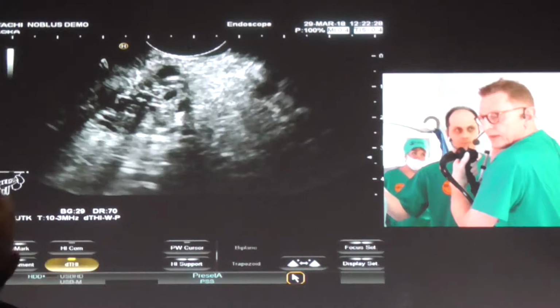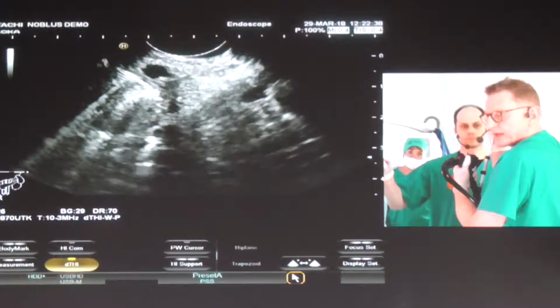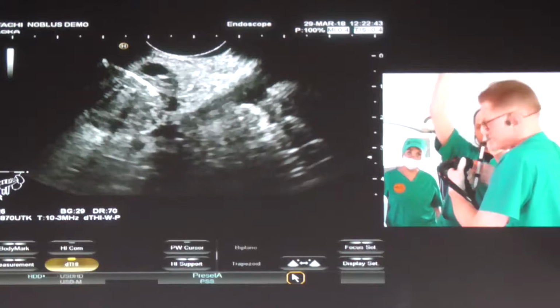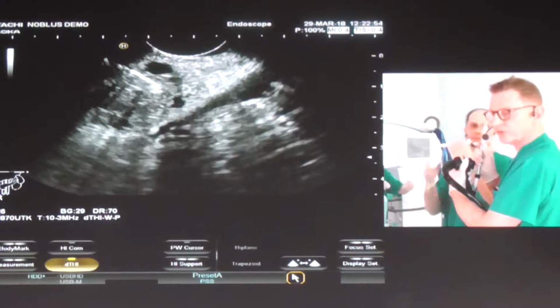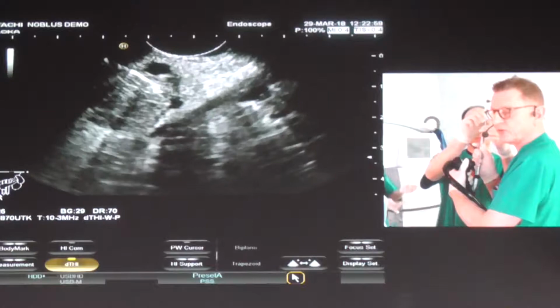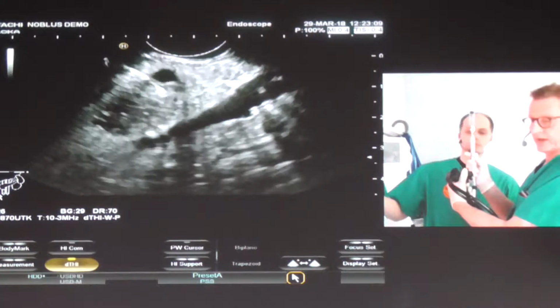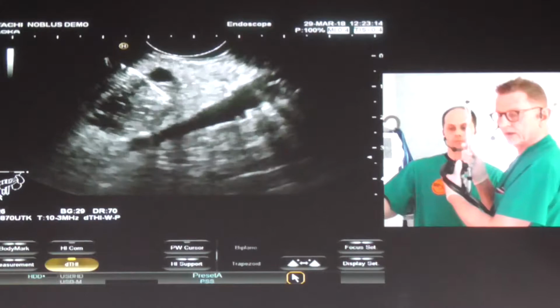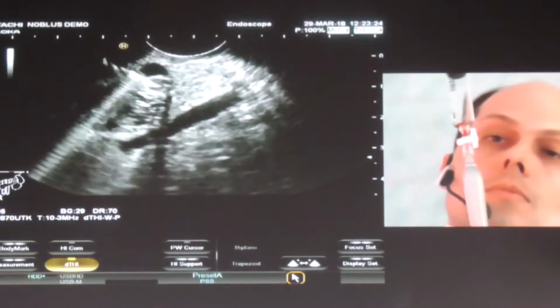It has a round stylet, so I have to retract the stylet. And now the needle comes in. Can you see it? Yes, we can see it. So if we take the stylet away, and then we aspirate. Usually these kinds of cysts don't contain that much fluid, and in my experience I hardly get good material for CEA and amylase and CA 19-9. Now the needle is moved back and forth, the piston is controlled, and I can exactly see where I'm at with the needle, as you can see here, and a little material is coming up. Usually also these lesions tend to be pretty bloody.